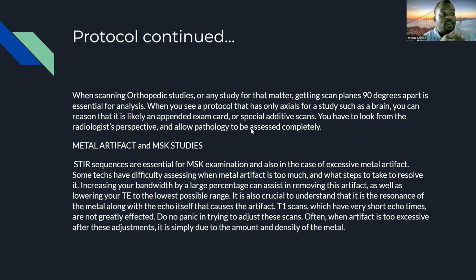Because you're also going to deal with these artifacts. Artifacts occur when there's some type of an infiltration of radio frequency into the field, some kind of an obstruction, or maybe an oversaturation of fluid. A big artifact actually is one where there's too much fluid in the liver, and it actually completely skews abdominal imaging and creates very severe artifacts that can actually mimic pathology.